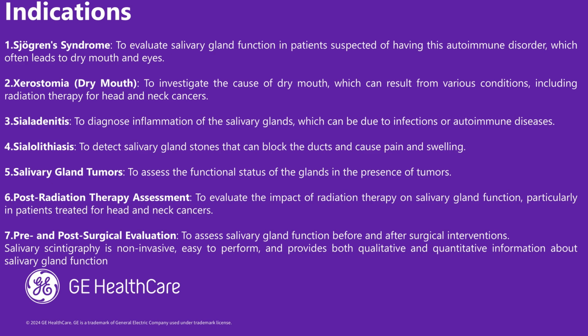Then pre and post surgical evaluation, to assess salivary gland function before and after surgical intervention. Salivary scintigraphy is non-invasive, easy to perform, and provides both quantitative and qualitative information about the salivary gland function.